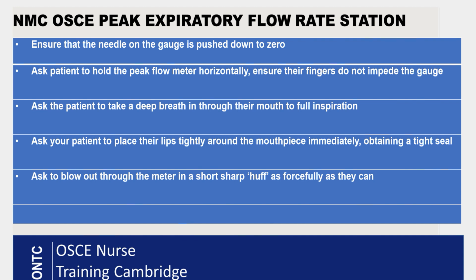Okay, once they've got a tight seal, then you're going to ask the patient to blow out through the meter in a short sharp huff as forcefully as your patient can, because you want them to blow into the peak flow meter in one blow. Okay, and that should move your pointer and give you a reading.